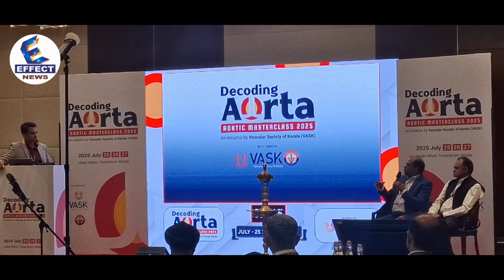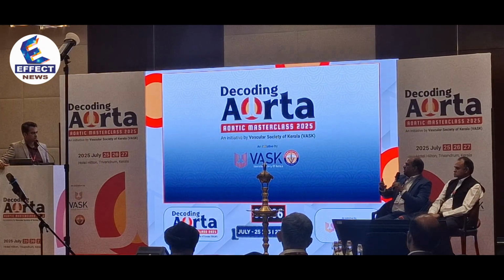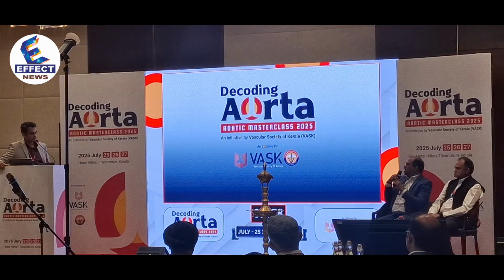So that's the difference, whether you are planning for open surgery or endovascular. If you are planning for open surgery, all you are looking at is grossly that there is nothing else. It's not the aorta you are concentrating on, it's about the other things you have explained, whether there is a vein behind, anything abnormal, or any malignancies or other things that you would like to avoid.